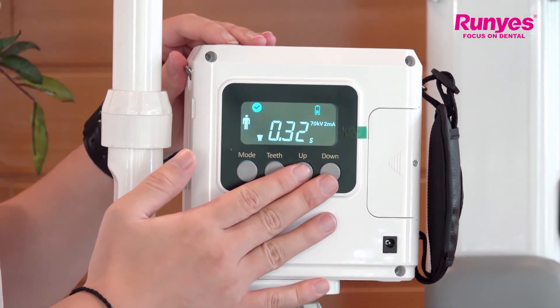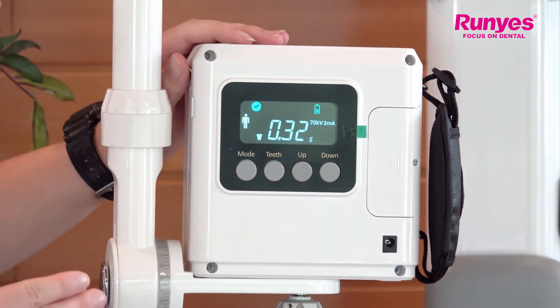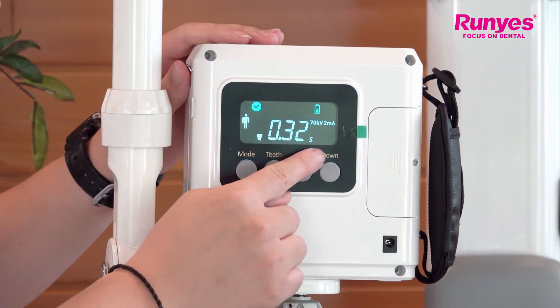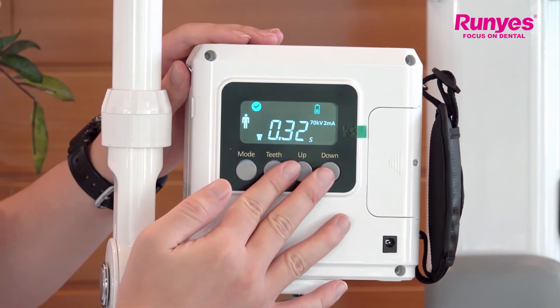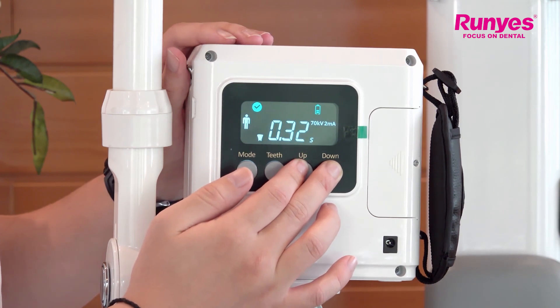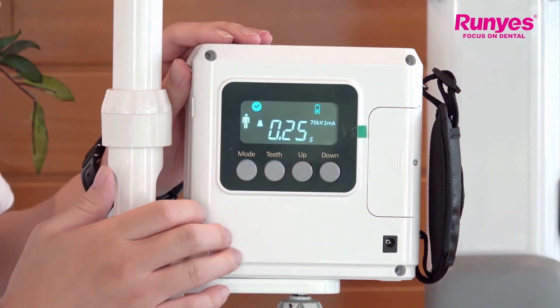You will hear the device give two beeps, which means the time has been set as the default. So every time you select these two, the exposure time will be this exposure time. If you want to reset the exposure time, long press the up and down key for three seconds, and after the device gives two beeps, keep pressing for about 10 seconds. The device gives a long beep — release the button to restore the factory state.